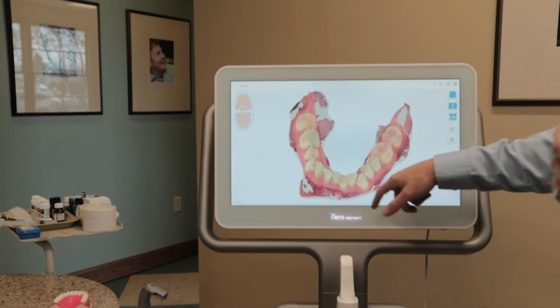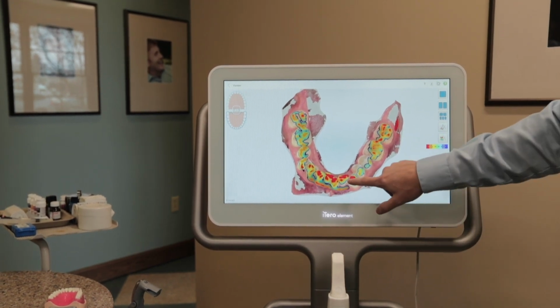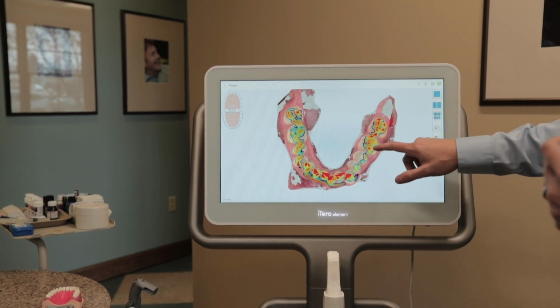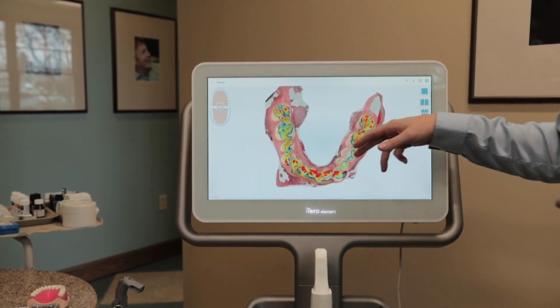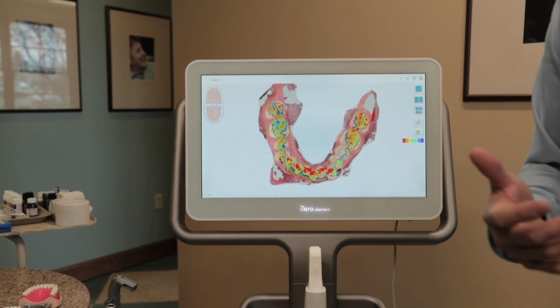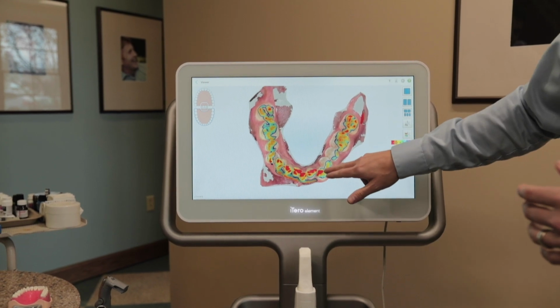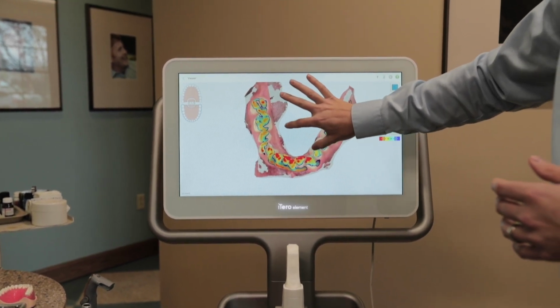So this patient has severe crowding, and what we're going to do is turn on what's called the occlusogram. So this is going to show where this patient has contact points. People always think red is bad. Well, yeah, red is bad, but without red in the posterior, they wouldn't be able to chew, right? So it's all about where those contact points are and exactly getting them in the proper spot so we don't have excessive wear that creates areas of concern.